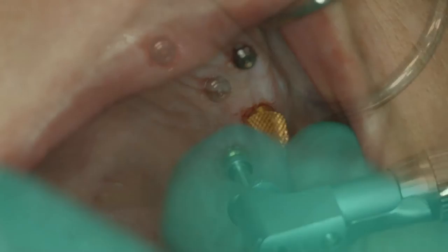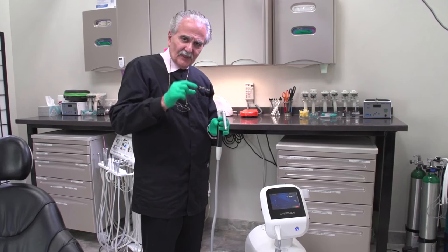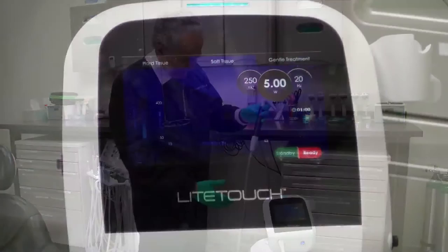Of course, if you put in an abutment that's eight or nine millimeters, it takes up more space. So what I did is just reduced it down — as long as I had attached gingiva, I reduced the sulcus to a three millimeter depth. Put in the abutment, checked it, felt it didn't have enough off, and I can go back — it's bloodless and very easy to do. You can also do frenectomies and hard tissue with this.